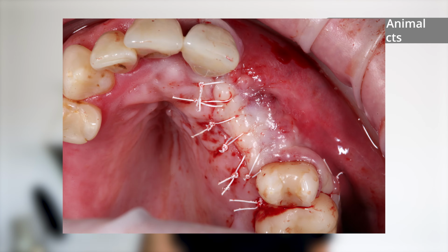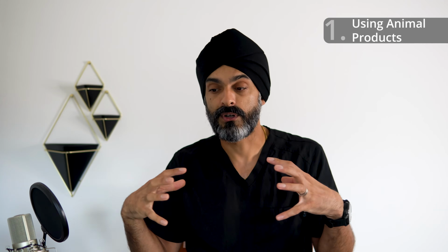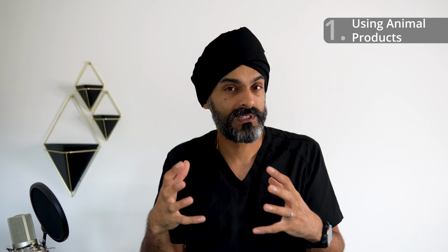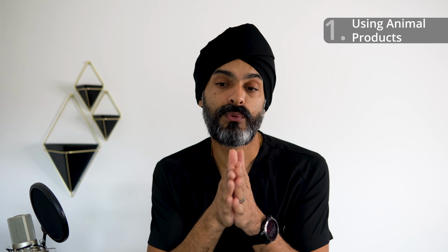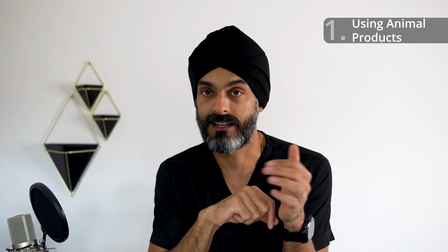Now what happens is the way that this turns into own bone is that your own bone will grow into the gaps between these sand particles. And over time, this area which was all this graft material, the graft acts like a scaffolding and your own bone grows into that. So then we have a nice thick piece of bone where we can place our implants.